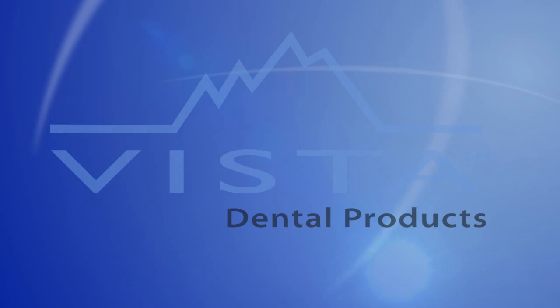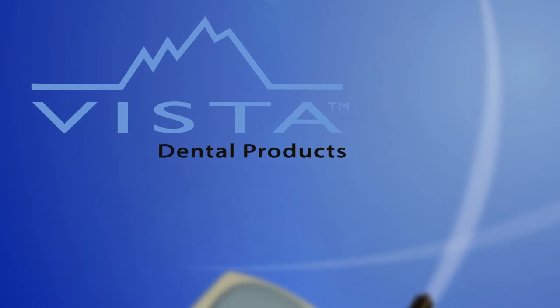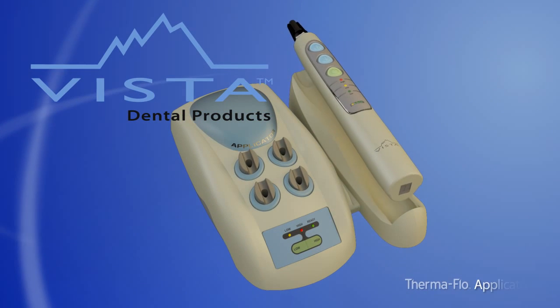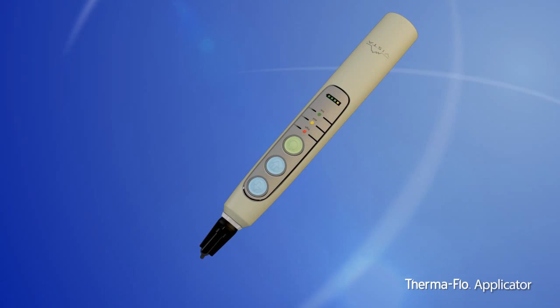Vista Dental is revolutionizing resin restoration procedures with the Thermaflow applicator. This product is uniquely engineered to heat composite material, improving the flowability of highly filled composites by more than 100%.